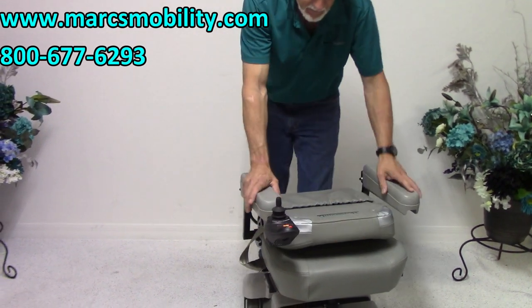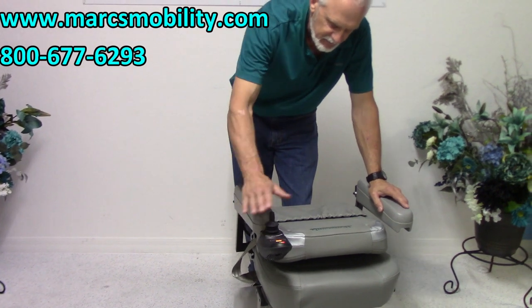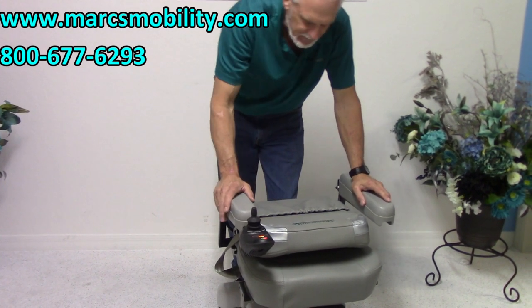This is a flip-down seat, so if you're going to carry this, the height here is about 33 to 34 inches.